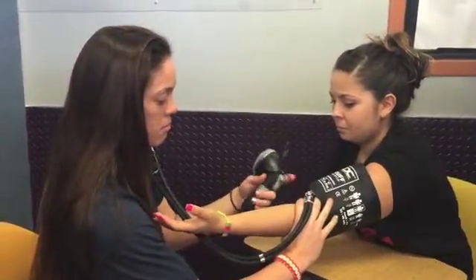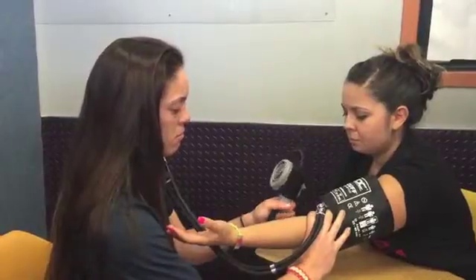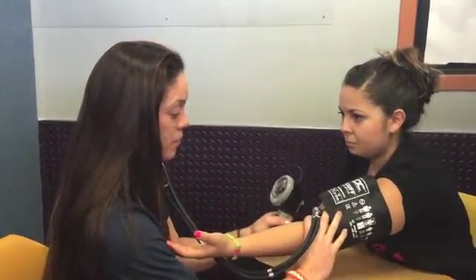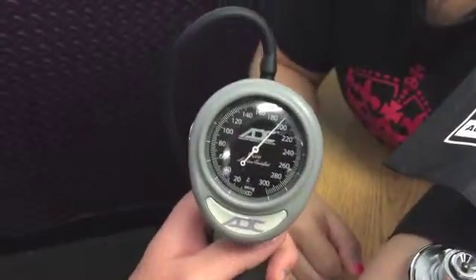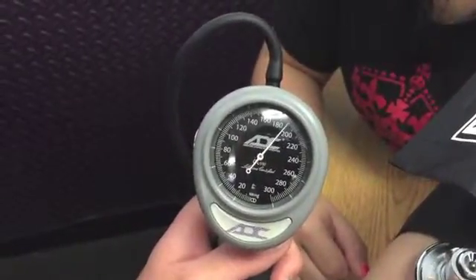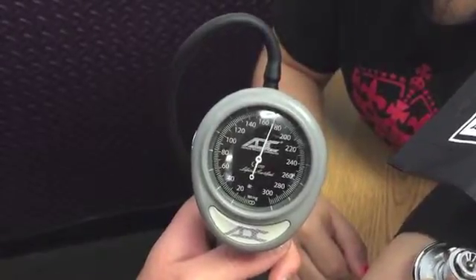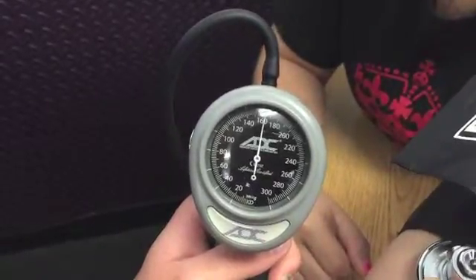Next, make sure the lever on the back is pushed up and inflate the cuff to about 200 millimeters of mercury. You want to slowly release the pressure at about 2 to 5 millimeters of mercury per second.